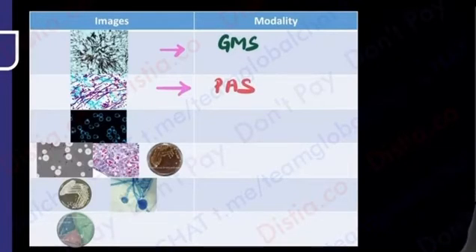Coming to next, something is becoming fluorescent. As soon as we say fluorescent, we are going to use calcofluor white. Remember, fluor had the word fluorescent, calcofluor white. Look at the next three. The next three are for the same organism, and that is Cryptococcus.